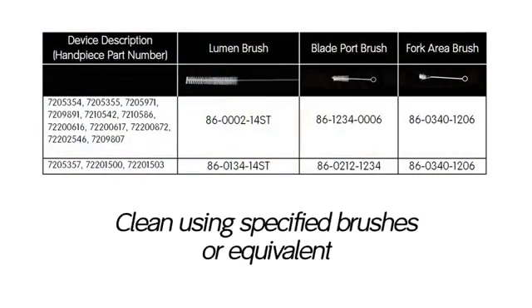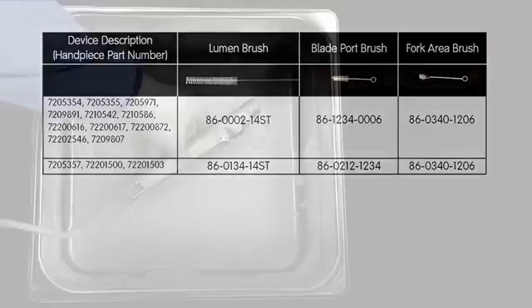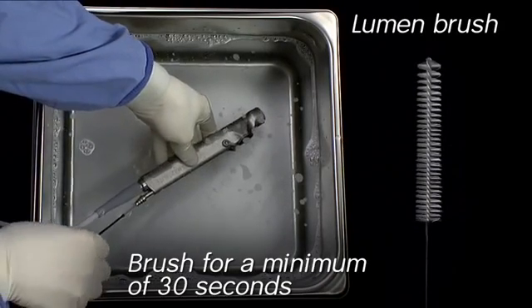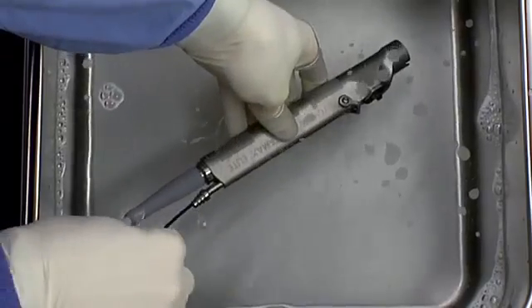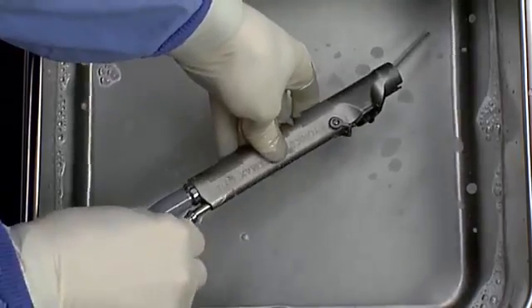While the unit is immersed, clean using the specified brushes from Brushes Corporation or equivalent as listed in the table. With the suction control lever in the open position, insert the lumen brush in the device spigot at the proximal end of the device, and clean the lumen using twisting and in-and-out movements of the brush for a minimum of 30 seconds.